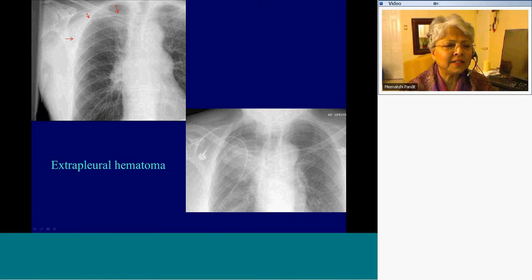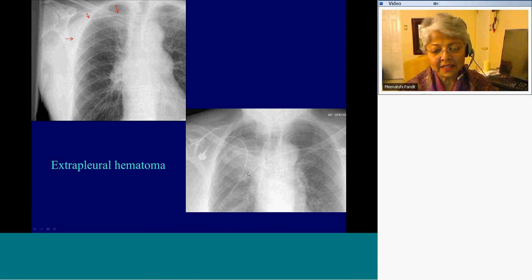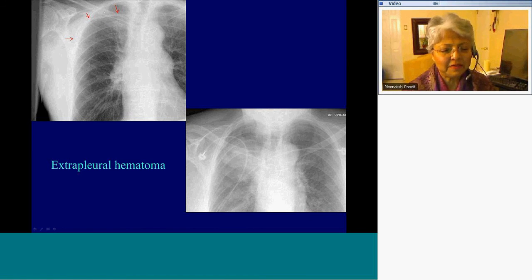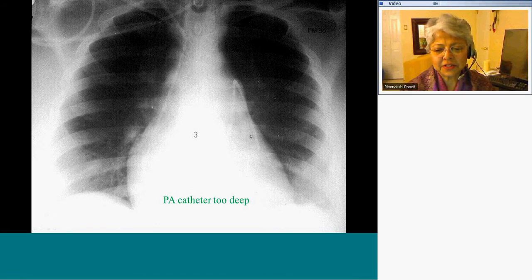This patient had a right-sided subclavian catheter placement — they were not able to infuse much. After removal, the radiograph showed that most of the collection was anteriorly in the retroclavicular space — this was a misplaced subclavian catheter with an extrapleural hematoma. Complications of the PA catheter include pulmonary infarction, arrhythmias, pulmonary pseudoaneurysm, and knotting of the catheter. This PA catheter is too deep — it should be no more than three centimeters past the spine; anything beyond that is too deep and likely to cause problems.